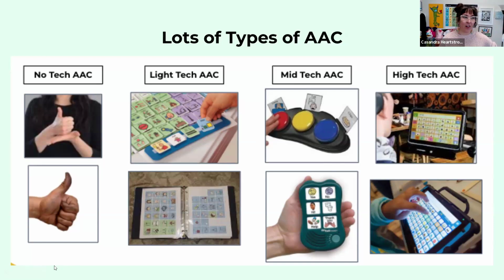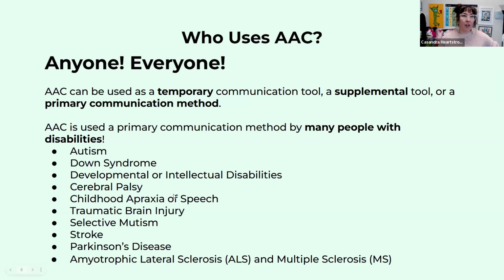And then high tech's got all of those words that we use all the time. Who uses AAC? Anyone and everyone. AAC can be a temporary supplemental communication method or a primary communication method.